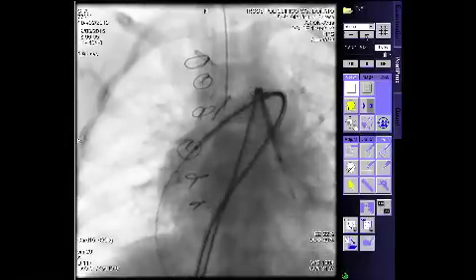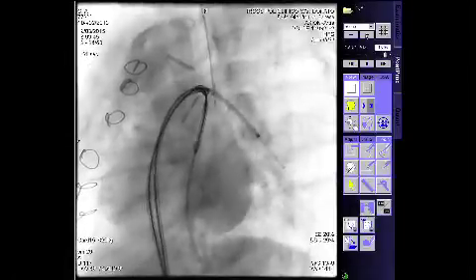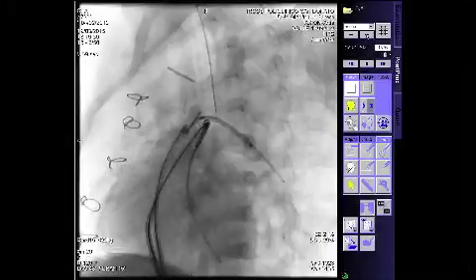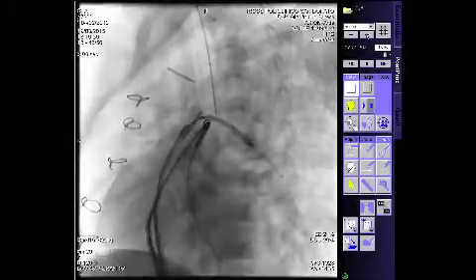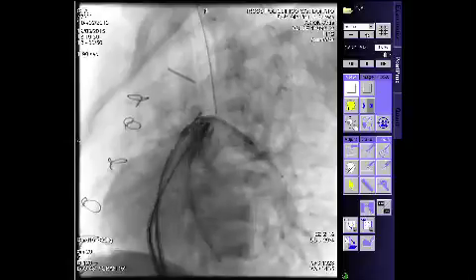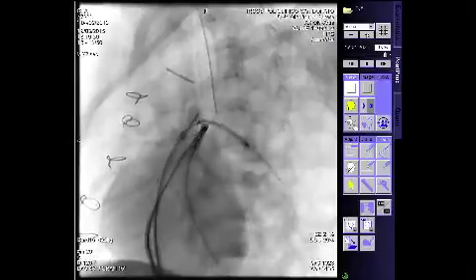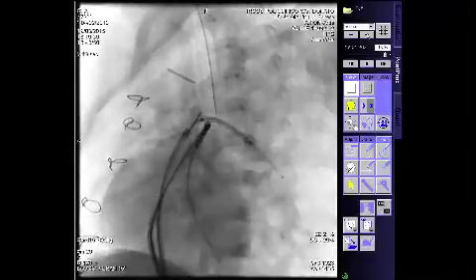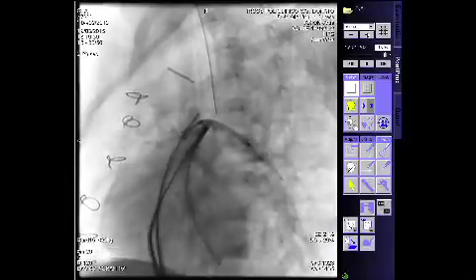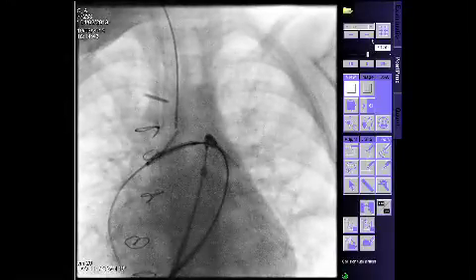Okay, now, Gianfranco, after all these comments, it's your job. We are watching. So I show you again the pictures, the angios. I think that I should go for the left first, because it's more difficult. And then if we want to adjust, we may deflate but leave the balloon inside. Then if we need to adjust the position of the right, I think it will be a bit easier. Position of the left looks okay to me. We may check again on the other projection.